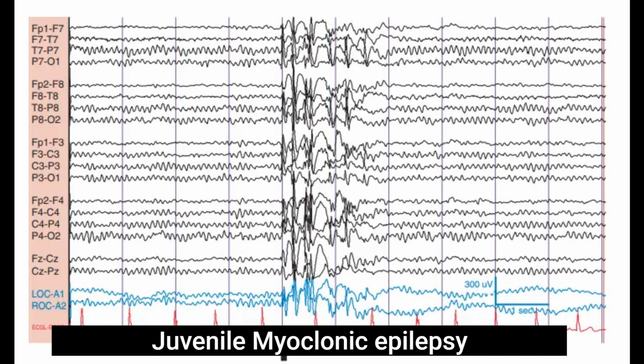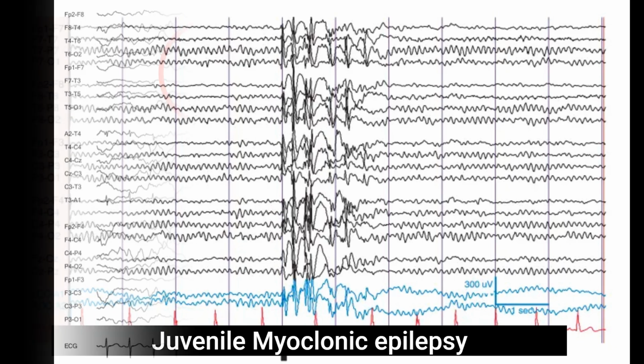It all comes down to analyzing the waveform carefully, understanding its distribution across the scalp. So even the benign patterns can be tricky. They can be, if you don't know what you're looking at. That's why the expertise of the EEG interpreter is so important. They're like brain detectives. Yeah, brainwave detectives. Okay, so we've got those. What else do we have?